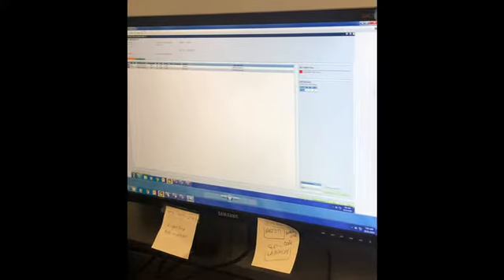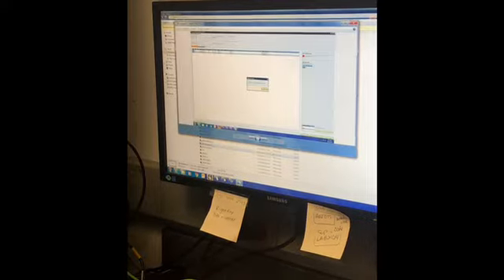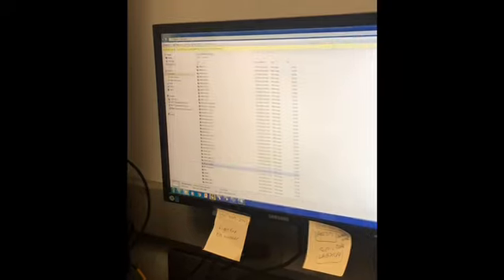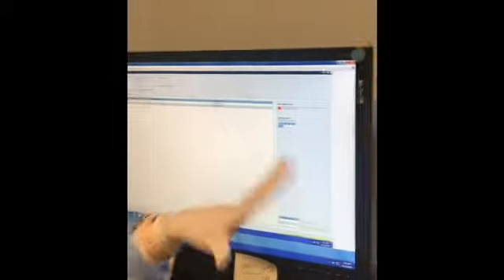All right. And once you select release batch, we're gonna have to grade them and everything, or it's not gonna come up what it's supposed to. We're gonna have to put our grade. No, that's what I'm showing you. No, it's already done for you. Oh, okay. Everything's been transferred for you. Oh, okay.